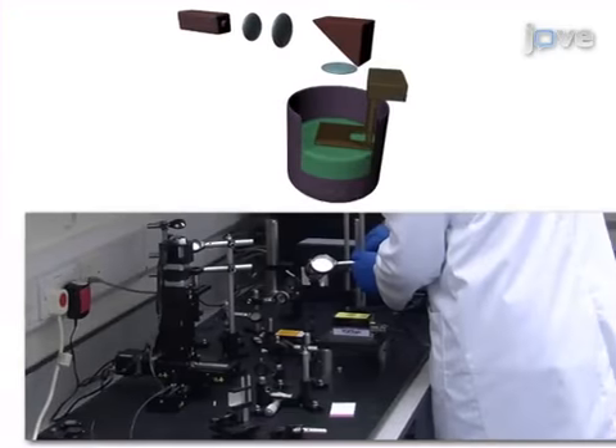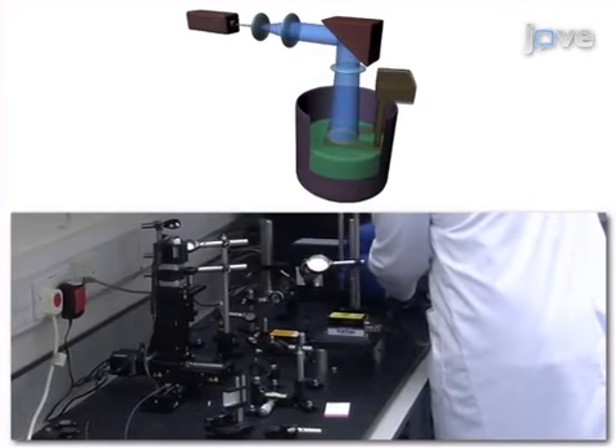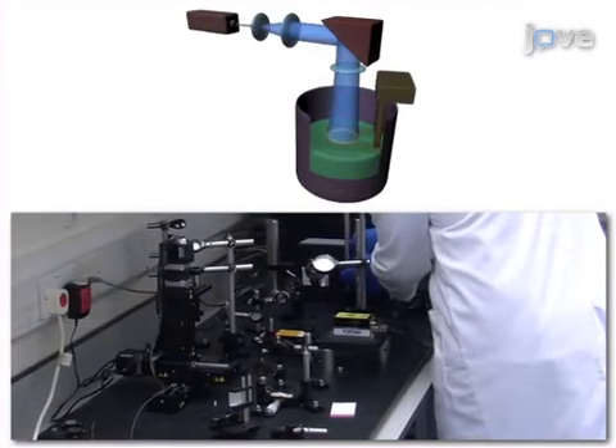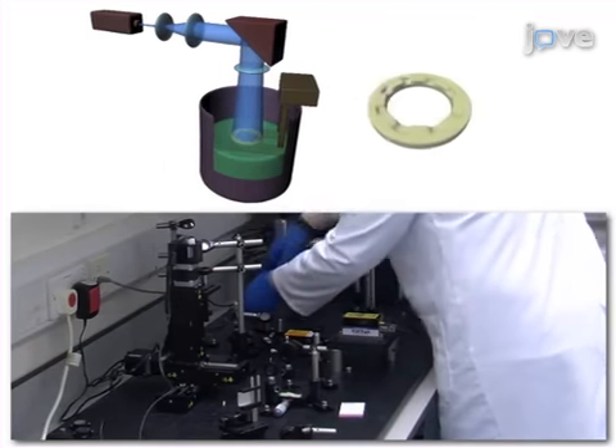This is achieved by creating a non-degradable template made of polyethylene glycol diacrylate, or PEGDA, using a layer-by-layer photocuring technique called microstereolithography.